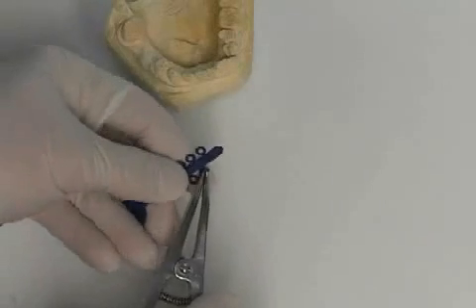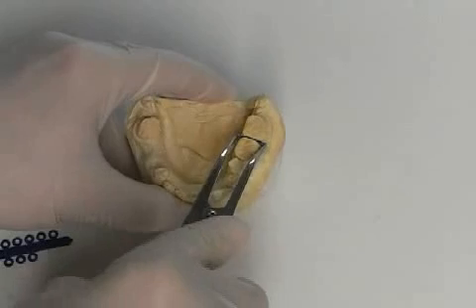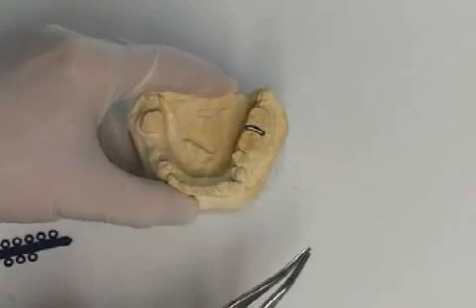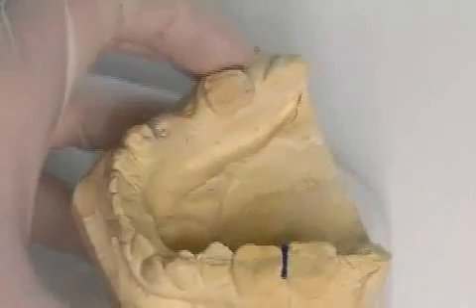So, we've established that in order to separate the teeth, so-called separating rubbers are placed between the teeth. They push the teeth slightly and painlessly apart, so that the contact surfaces are dissolved. You hardly feel the separation rubbers, and they don't hinder you when eating or talking. Sometimes such a rubber is lost or swallowed, but this isn't really a problem — the dentist will simply insert a new one.